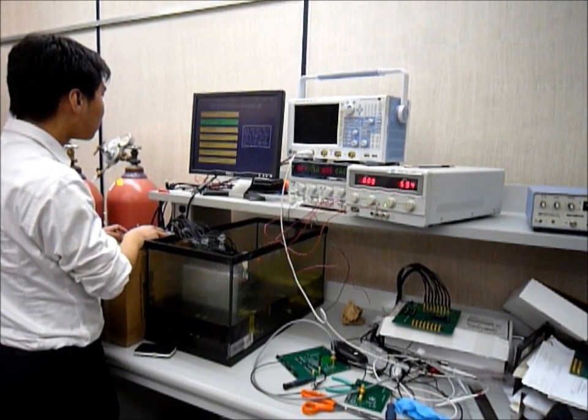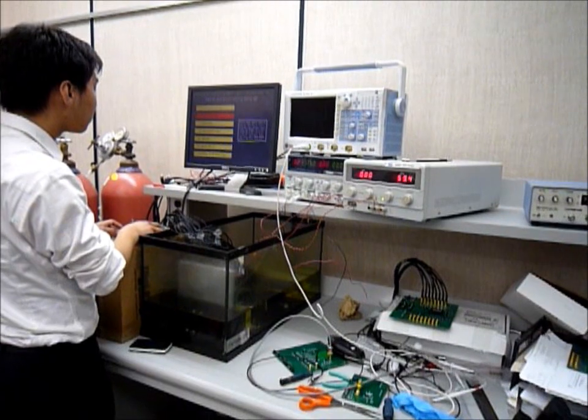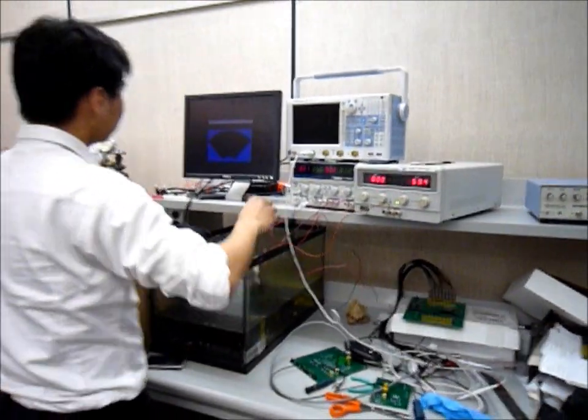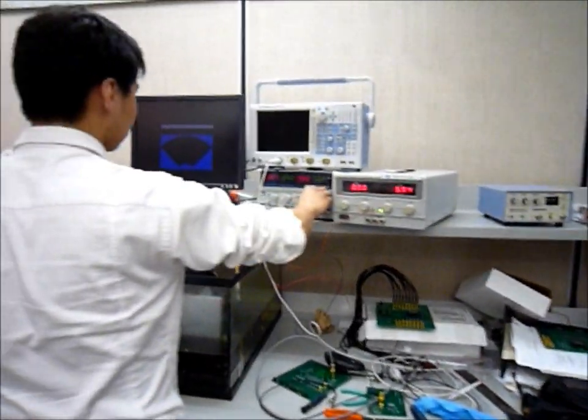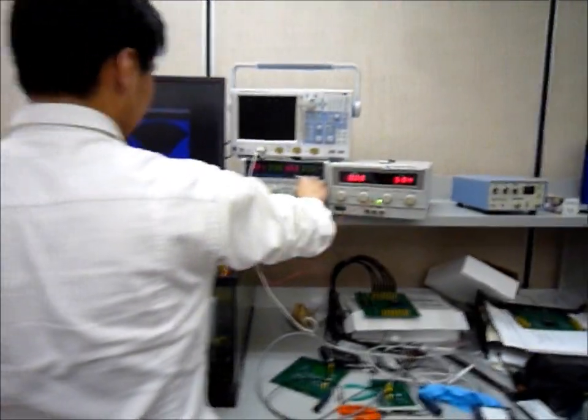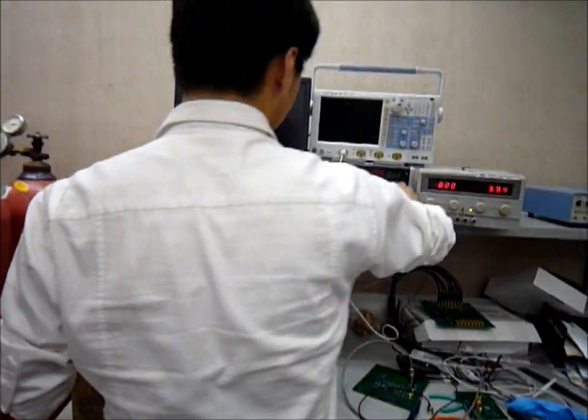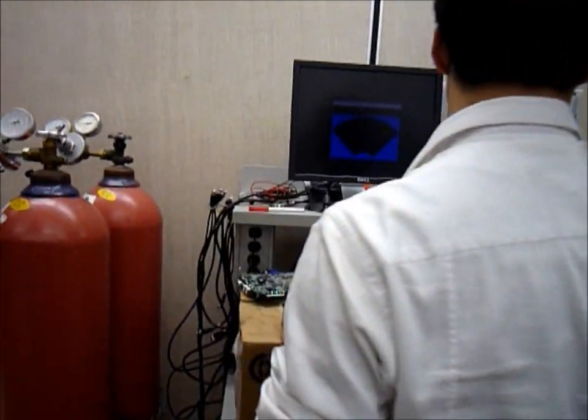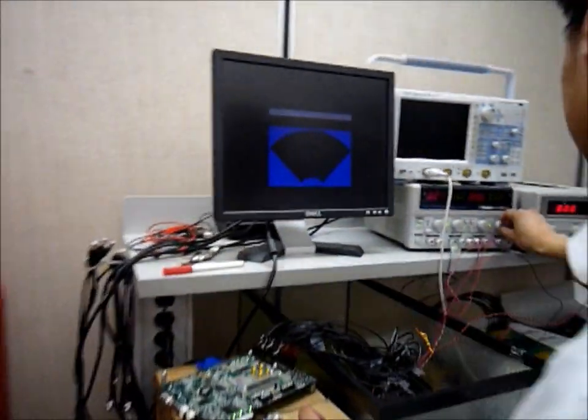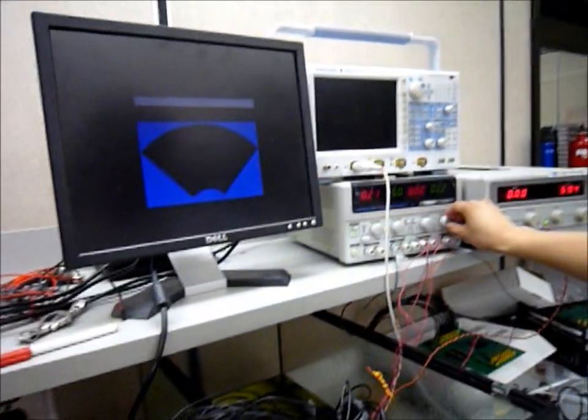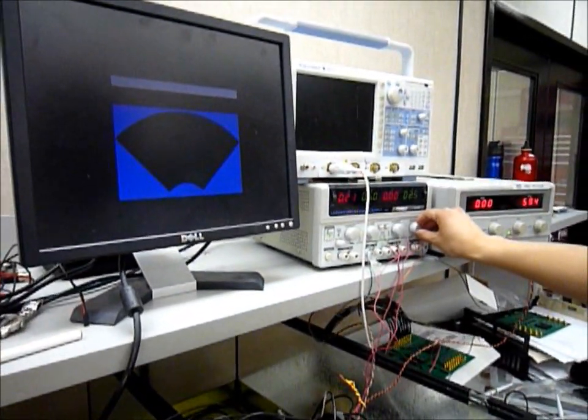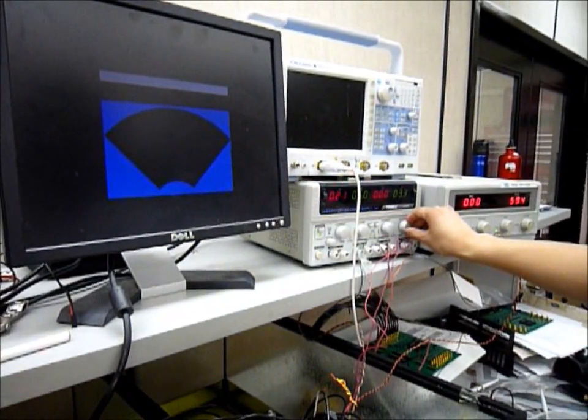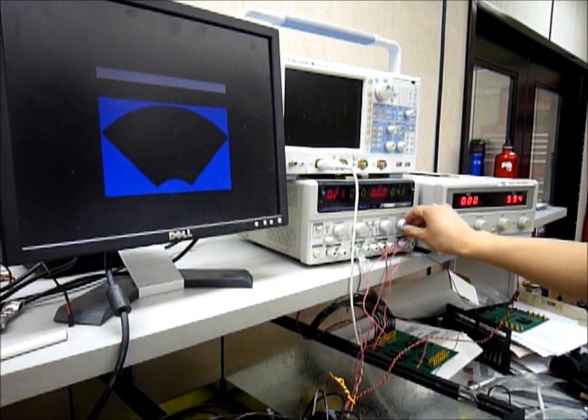After that, the FPGA, the printed circuit board, and the analog-to-digital converter are all connected together with wires. The printed circuit board with the CMUT is submerged in the tank of oil, so we have a more viscous medium to simulate the effects.